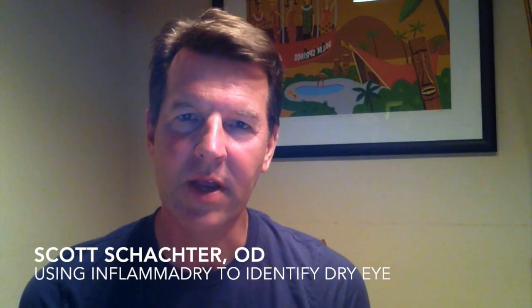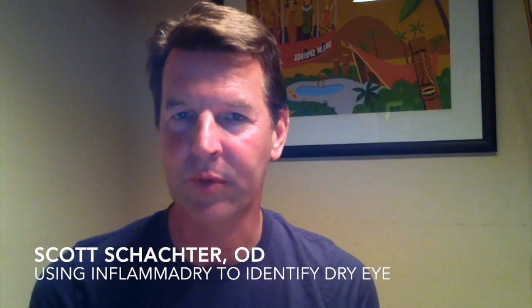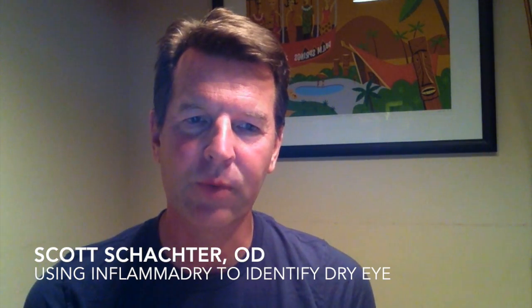I want to talk today about dry eye testing and one test in particular. In my practice, we measure lots of parameters like I'm sure you do. We screen with a SPEED test. We use Zone Quick to measure tear volume. We can measure meibography. We can measure non-invasive tear film breakup time. We can also look at lissamine green staining and fluorescein staining. And we can take a history in general looking for dry eye.